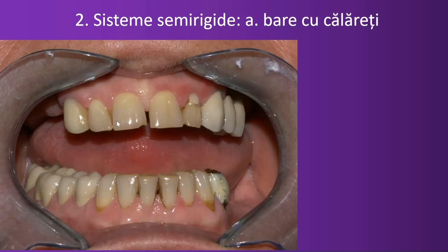You guess that here it's just a temporary crown, yeah? And I painted it a little bit to trick the eye, but that was a metal ceramic done by somebody, but it was looking like it was not from that mouth. So the patient wanted better aesthetics of the whole maxillary, not to speak about the inclination, the malposition of those teeth in the frontal zone.